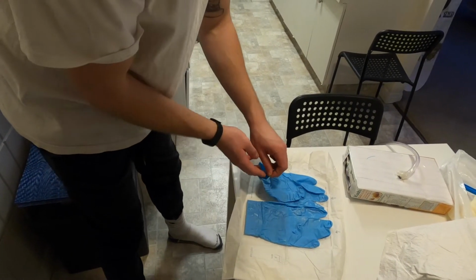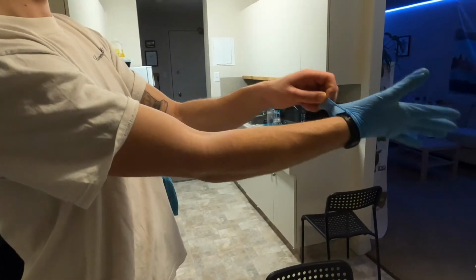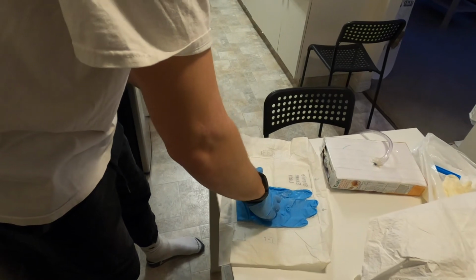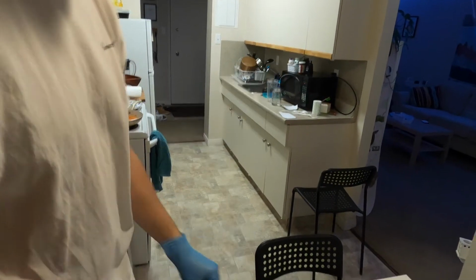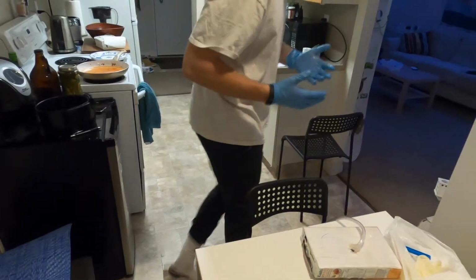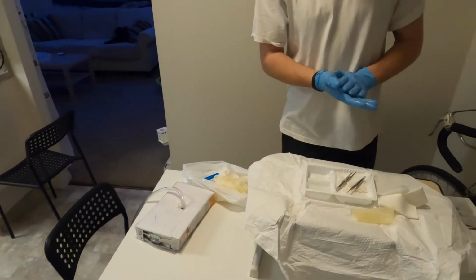So this, here. So I just pull up and away from myself. And then go under the cuff for this one. And pull up and away, so they're on. Good. And I can discard of this. So again, I wouldn't be dropping my hands below my waist, but since the workspace is below my waist, it's going to happen in the demo here.